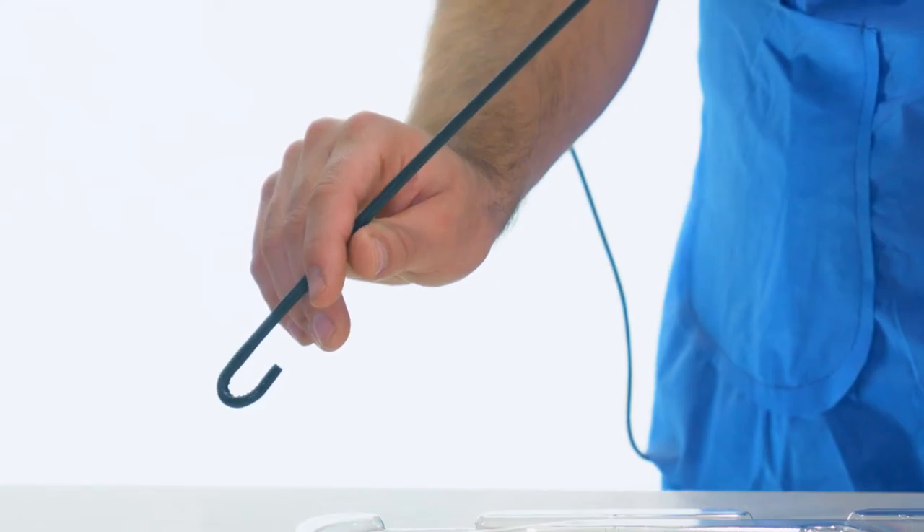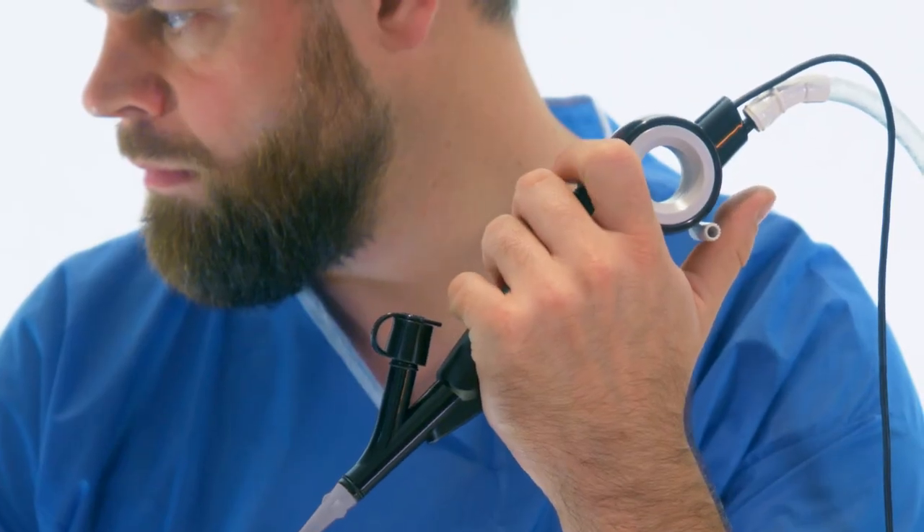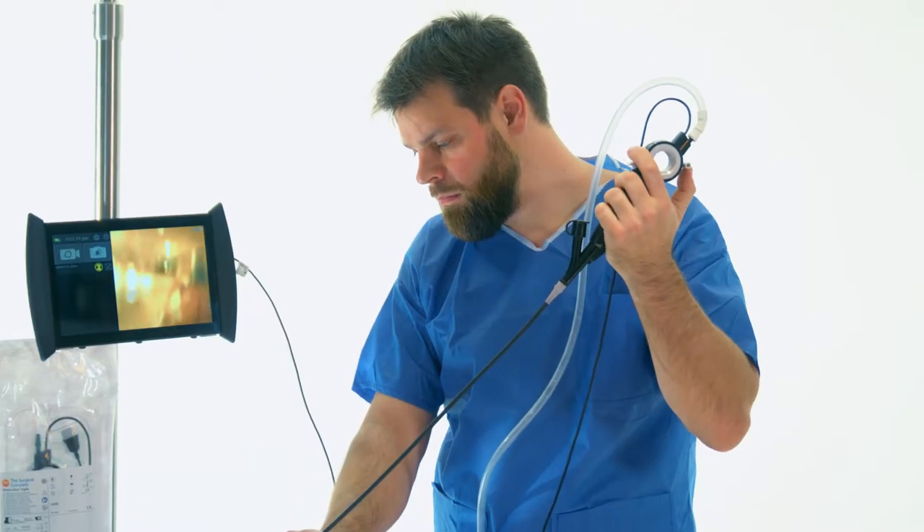Before using the product, control checks on bending, suction, and image display must be performed.